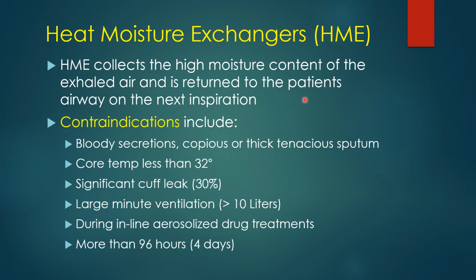And the good ones are about 70% efficient. So that means you have a humidity deficit when you're using one. But if it's not much of a humidity deficit, it should be okay. But it's also recommended that you not use it for longer than 4 days, and then it needs to be changed to an active humidifier.